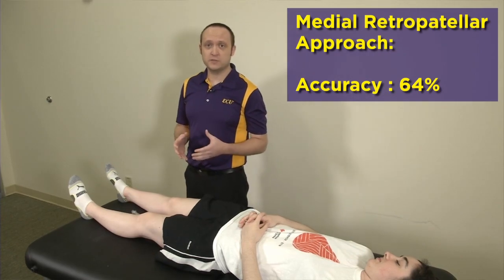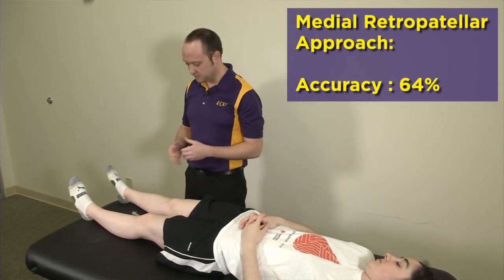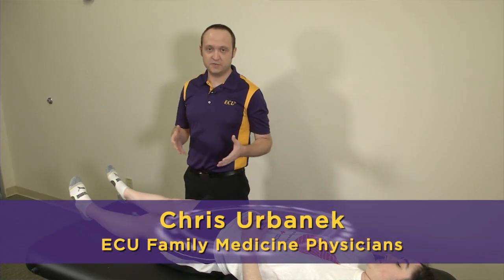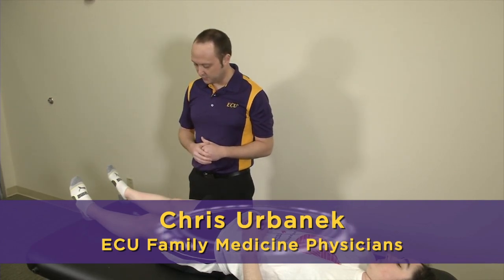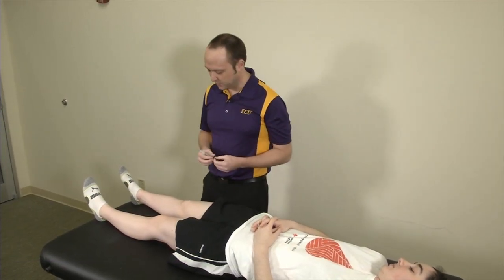We're going to start with the medial retropatellar approach. Certainly, this is all for demonstration purposes. We're going to be using blunted needles today. We want to make sure that as you're doing this, you're following universal precautions, making sure that you're certainly using sterile technique for your injections, and not using blunted needles like we are today.